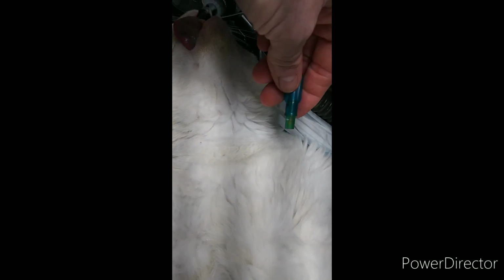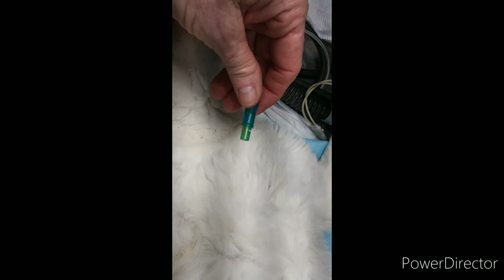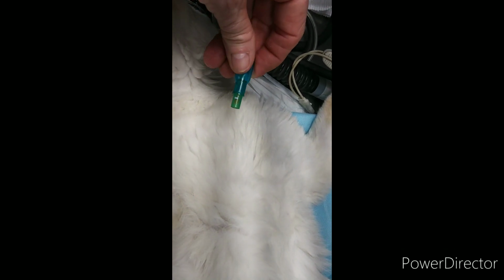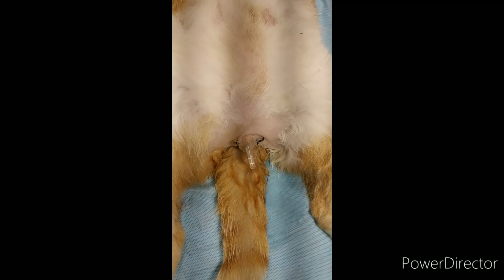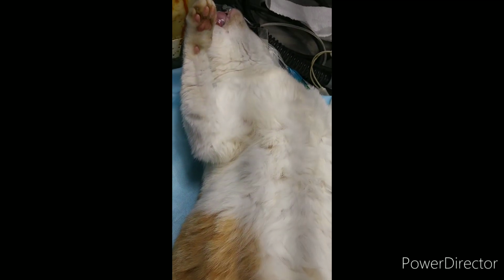Oh, by the way, I didn't give him any induction drugs. All I did was gas him down and then put lidocaine in his throat and then use a 3.5 internal diameter trach tube with a little balloon. Inflate partially, not all the way, just a little bit. Control any aspiration that could get into the lungs. Alright, and I'm going to put a head shield on him after I'm done.